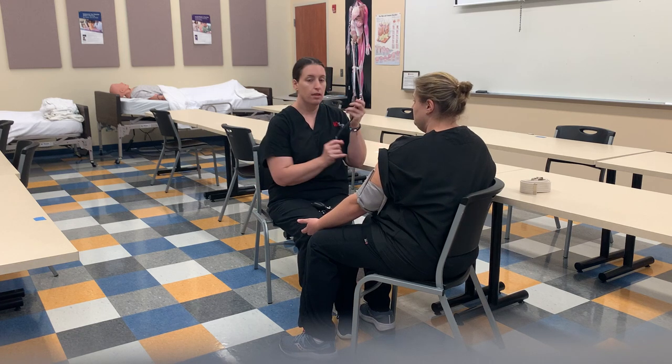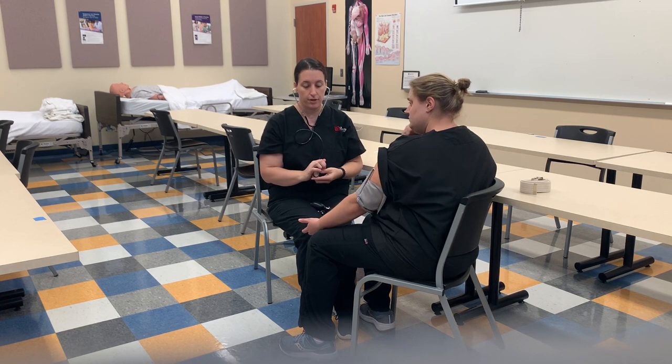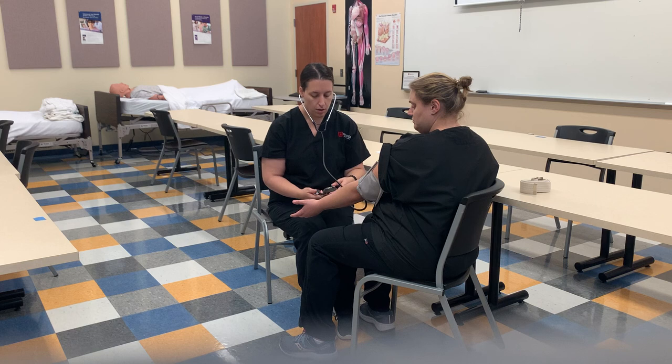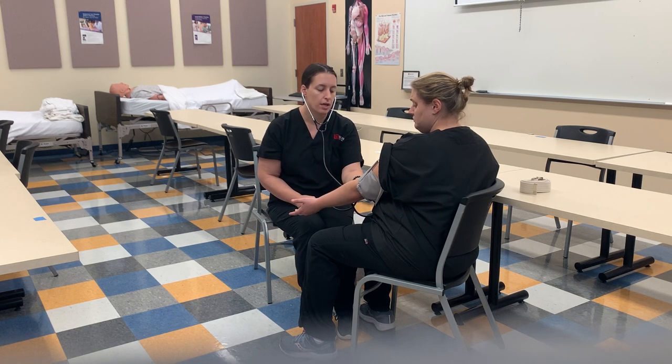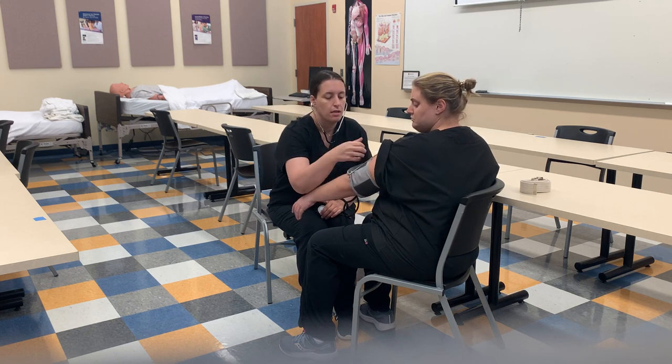Now we want to add the hearing part of the blood pressure. We put on our stethoscope, making sure the ears are covered so we have a very good seal and don't hear a lot of the surrounding environment. We place the stethoscope right where we palpated the brachial artery. We never put the thumb over the stethoscope because that has a natural pulse to it. We close up, hold our meter and stethoscope, pump up the blood pressure, then go nice and slow, listening. Then we release the blood pressure.